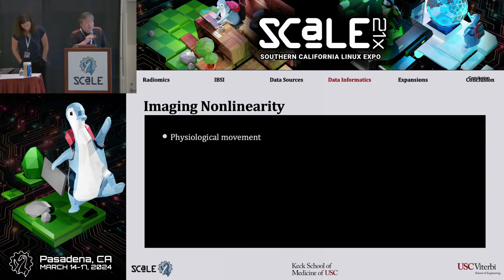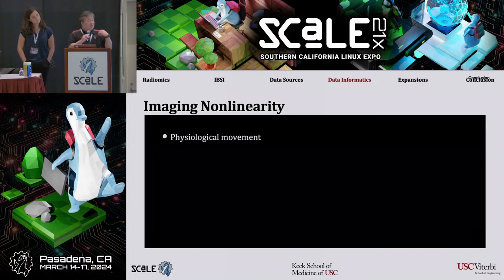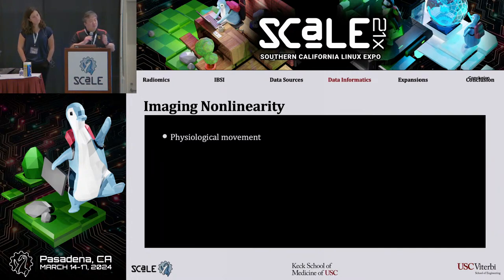Physiological motion. When you breathe, organs move. If you think about your kidneys or your lungs, if you're trying to image those structures, depending on what part of the breathing cycle you have when they're taking the image, your organs might be in completely different places. So there's an element of image registration, and that image registration has to occur in 3 dimensions to compensate for it. There's distortion as you're breathing, so your liver flaps like a manta ray. When that happens, you have to non-linearly warp that liver to fit a previous state so that you can do a comparison. So there are these physiological motions that you have to compensate for.